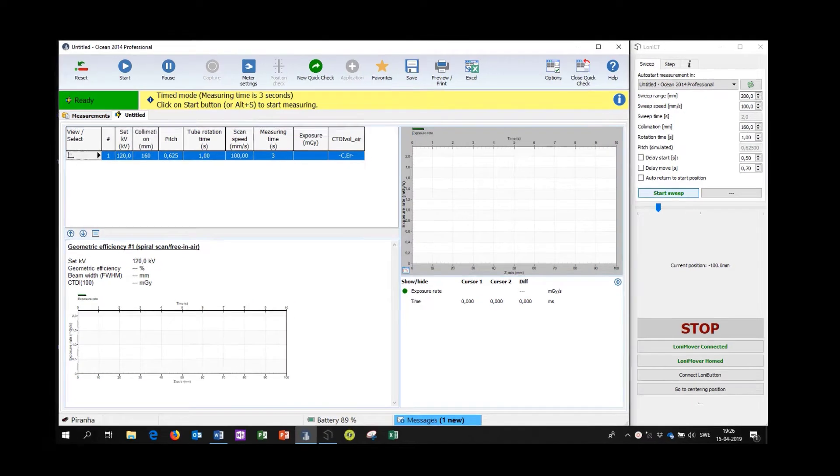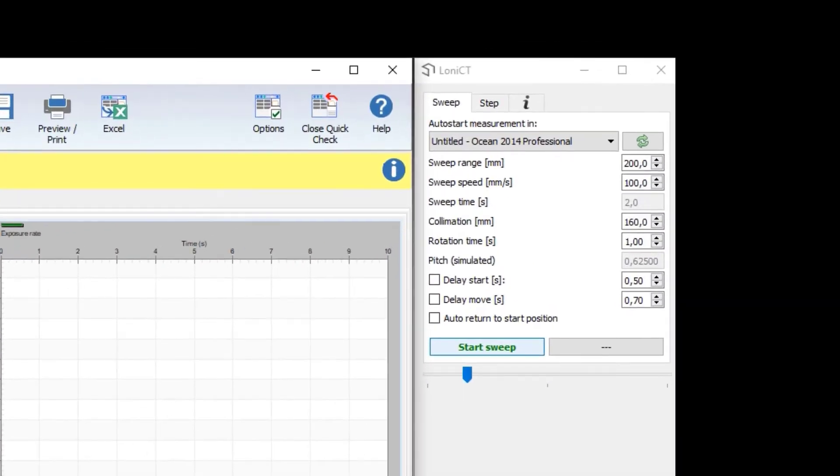The LONI mover is configured for a 200 mm sweep so that ample margin is ensured before and after the beam edges which should be about 160 mm apart.